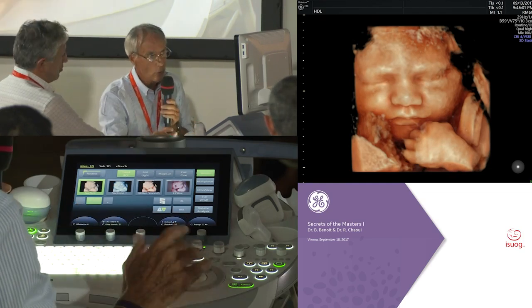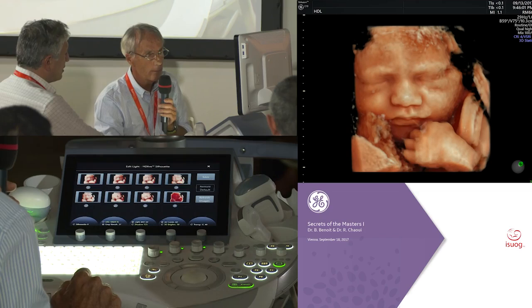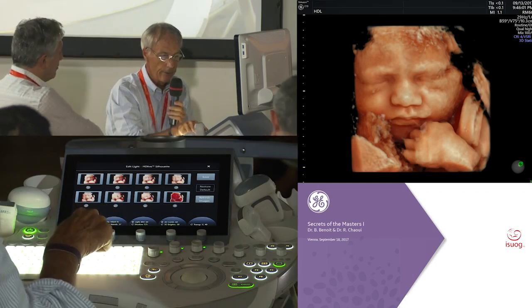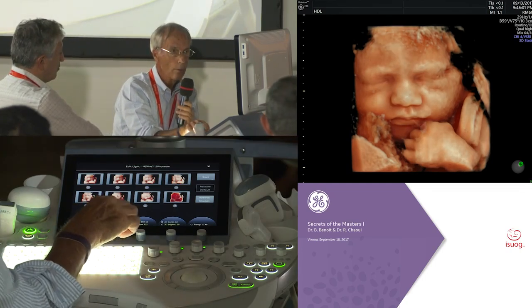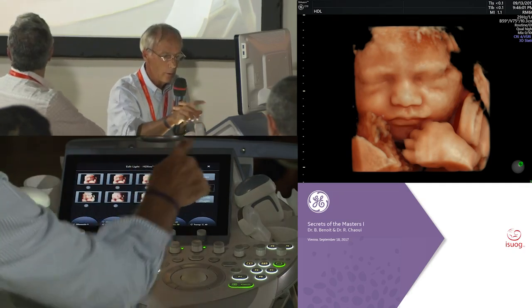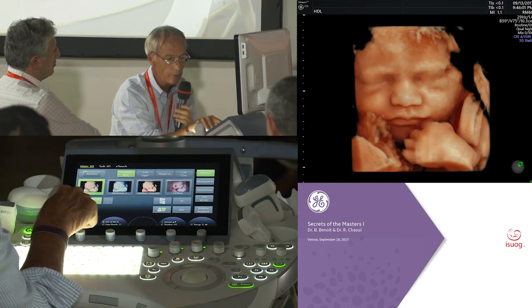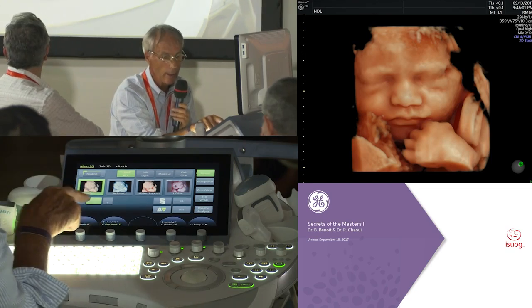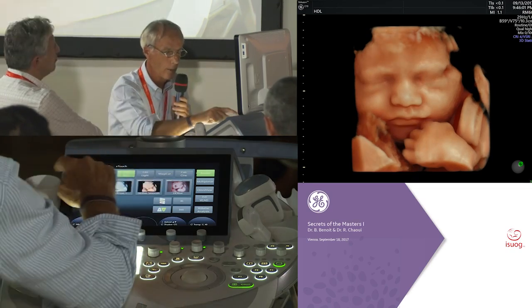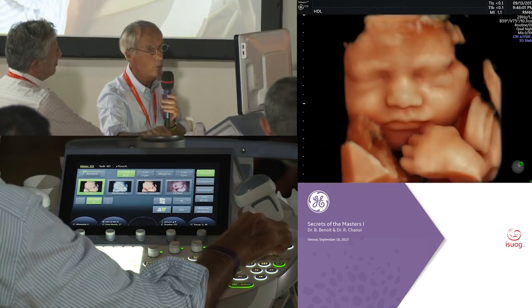And you change the position of the light. And do you keep it by texture or is it softness? Because you have 100%. Already it's 100% texture. And if I move here, you can move to 100% soft. It's softer. Yeah. And also really important for the face, if you use this system, the best setting for the volume SRI is level 4 because it's soft, and it's this one. And you can zoom. And this is really clear.